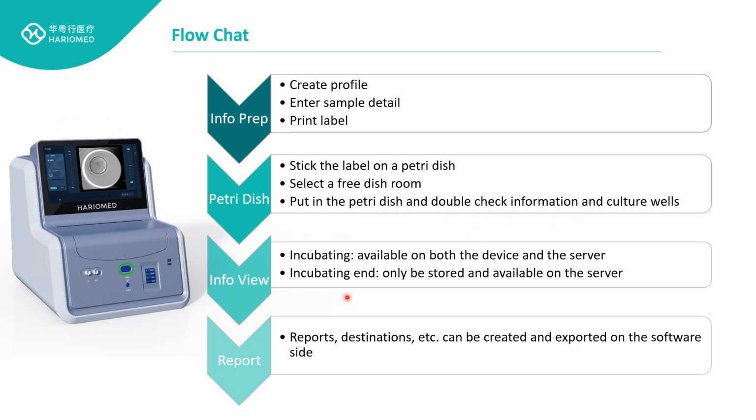And during the incubating, all the information like video, pictures, and all focal plane can be viewed both in the device and the server. And after the incubation ends, only the information will be stored in the server, so we can check the information in the computer site.